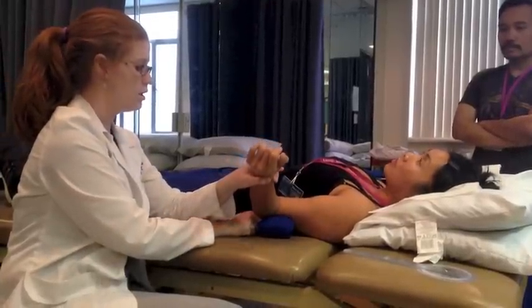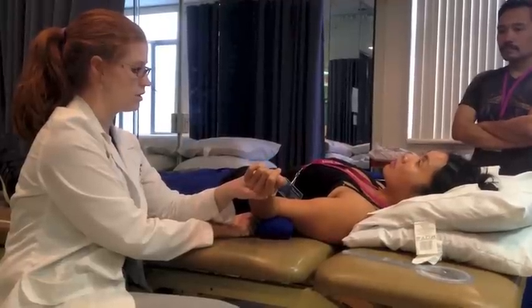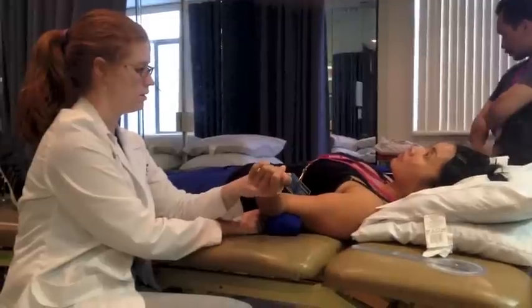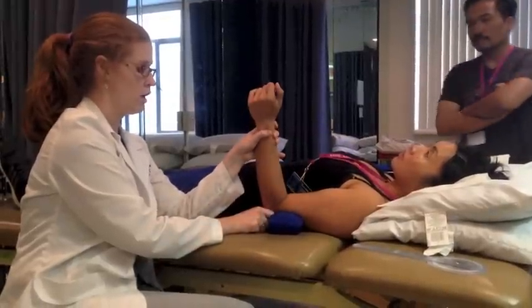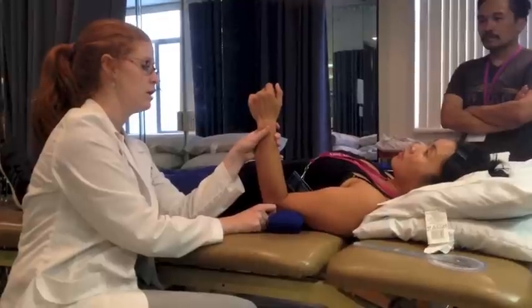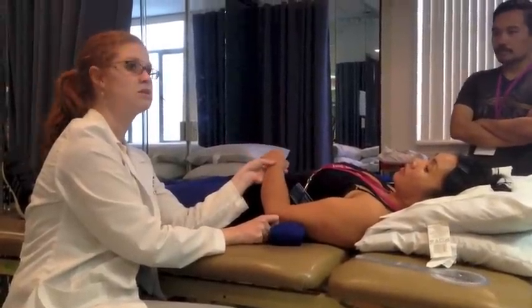And you're going to goni. Not quite 90 — what do we think that is? Maybe 70, maybe a little less. So that's lateral because this is zero. Medial — unless your patient's really restricted, the stomach will stop you.